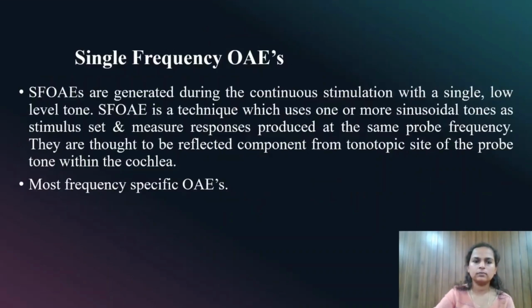Single frequency OAEs are generated during continuous stimulation with a single low level tone. SFOAE is a technique which uses one or more sinusoidal tones as the stimulus and measures responses produced at the same probe frequency. They are thought to be a reflected component from the tonotopic place of the probe tone within the cochlea. They are mostly frequency specific OAEs.